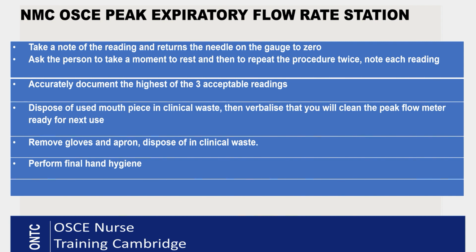Then you can take your gloves off, clean your hands, and then take your apron off and do your final hand hygiene. So that will be the end of your station.